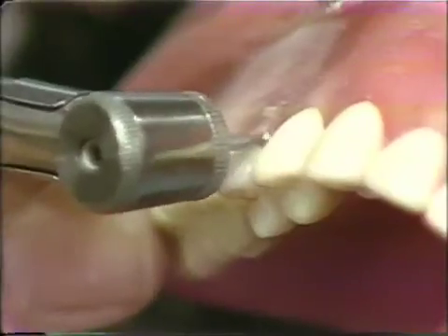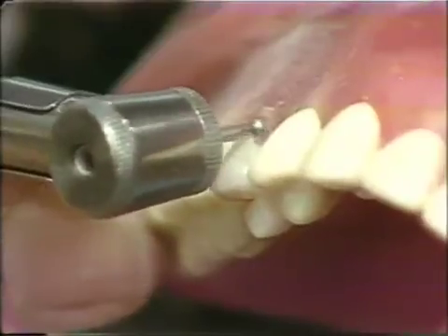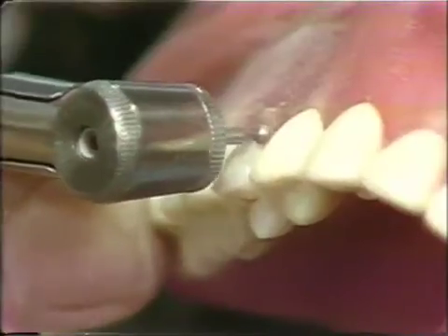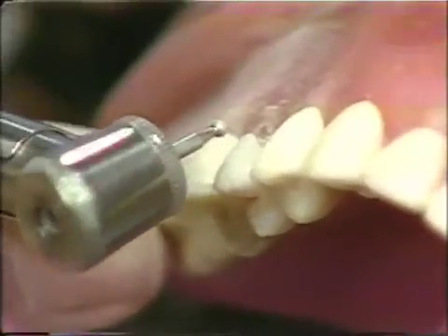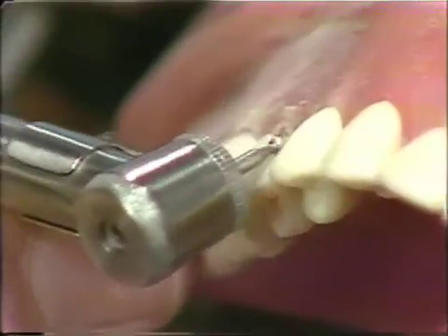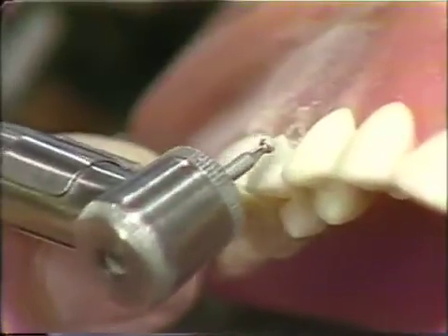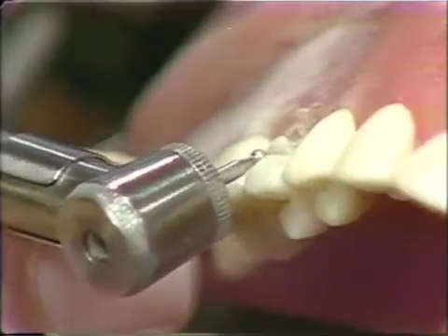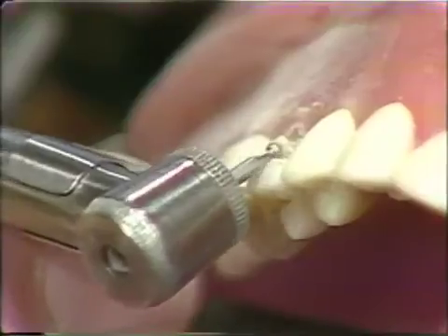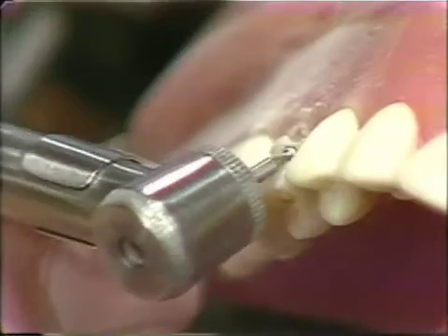Bring it in interproximally, slightly, both on the mesial and the distal. The mesial interproximal is the most important because that is where good color must be in order for this to appear as if it is a natural tooth. We will make another cut midway in the tooth, again utilizing the shank as a self-limiting factor in how deep this cut is made.